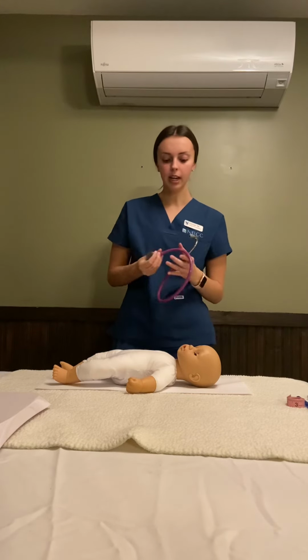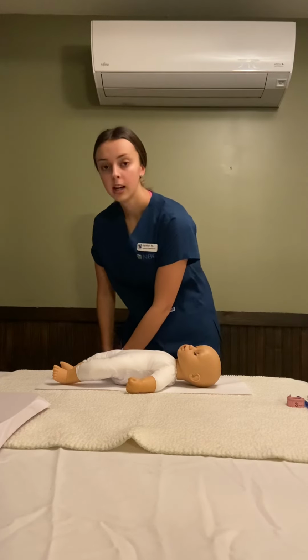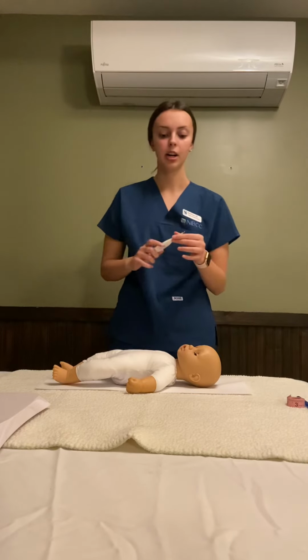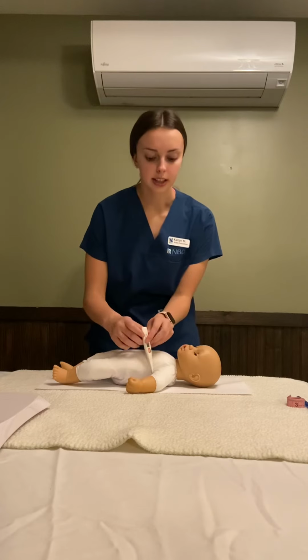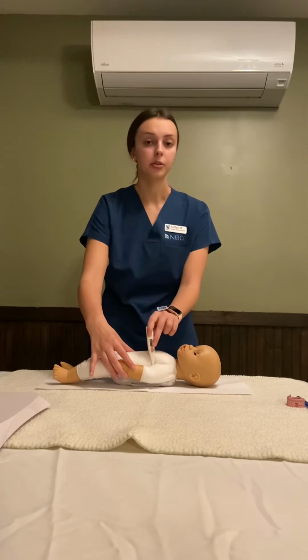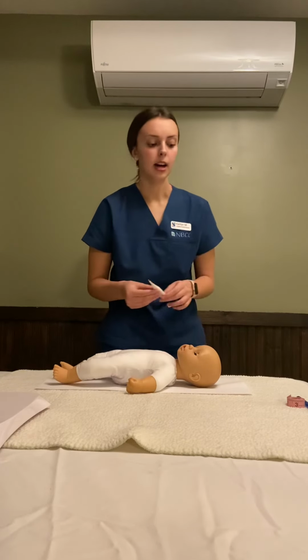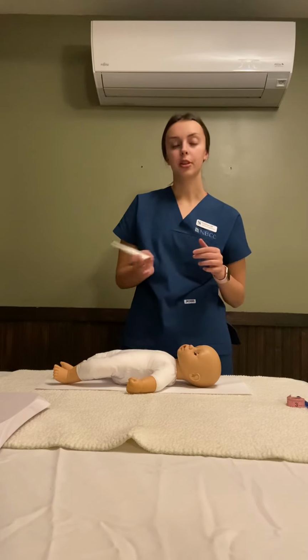And then after that, I'm going to take the axilla temperature. So take my thermometer, and you place the tip of the thermometer in the middle of the axilla, and you're going to place the arm closely by, and you're going to hold this for 1 minute until the thermometer beeps. And then typically a good temperature would be 36.5 to 37.